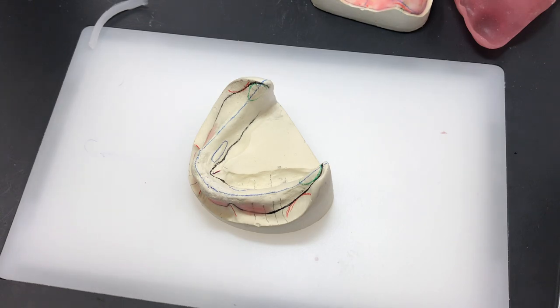So up until now, we've done almost exactly the same that we did on the maxillary cast. I blocked out my visible undercuts. I used a different type of wax to block out the retromylohyoid space, but everything else is exactly the same.